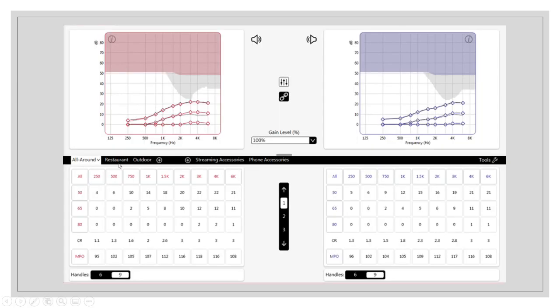If we have to change the values, here we have 2 kilohertz till 7 kilohertz, okay, 2 to 6, we will only change values at this point. In case it is a 4 channel or 4 band hearing aid, we are not going to have this many values here. It could be just 2 to 6 as one specific band. So in that case, we will be able to enter only one value.